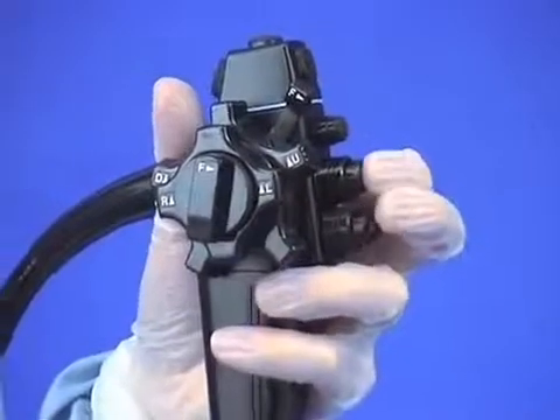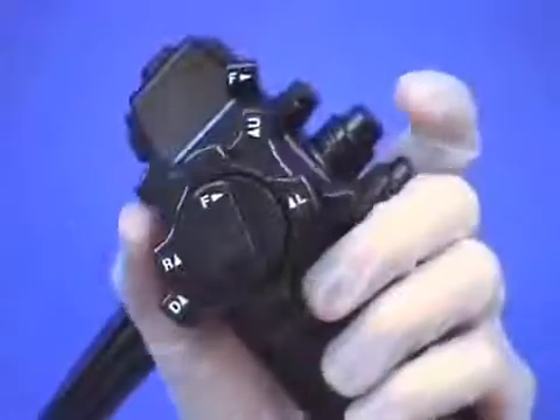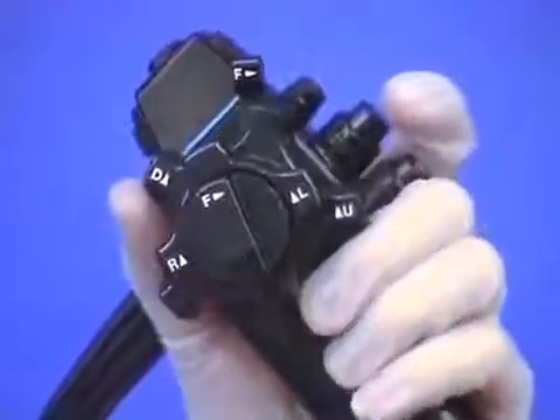Using two fingers to do this is a mistake, because the middle finger should be kept as a helper to the thumb, especially for full up-down angulation.